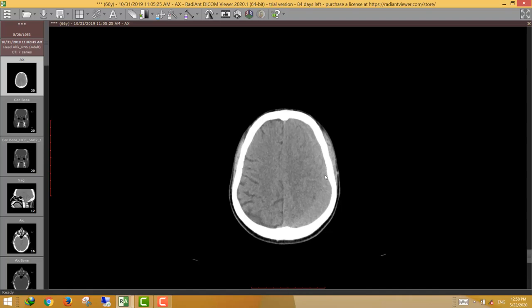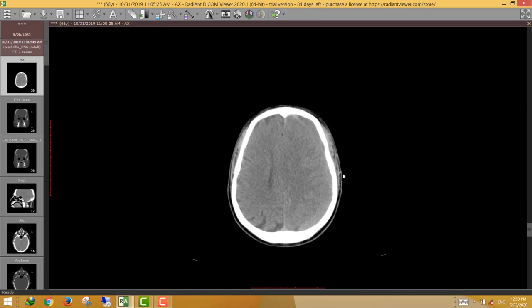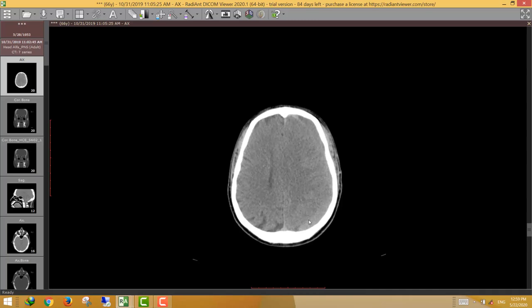These lesions or collections show extensive involvement of the left cerebral hemispheres, abutting the frontal, parietal, occipital, and even the temporal lobes. This is a typical example of subdural hematoma. In this case it is isodense to the brain parenchyma, so it is in the sub-acute stage. This stage is easily missed during examination as it is similar to the brain parenchyma, and if we do not concentrate we can easily miss such lesions.